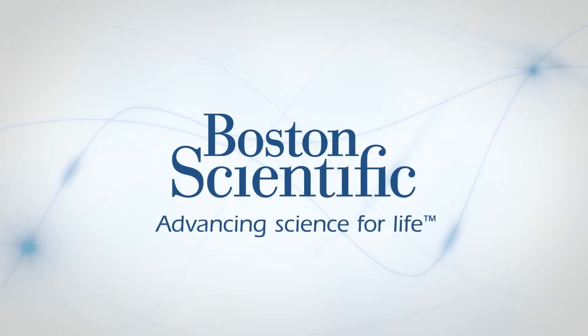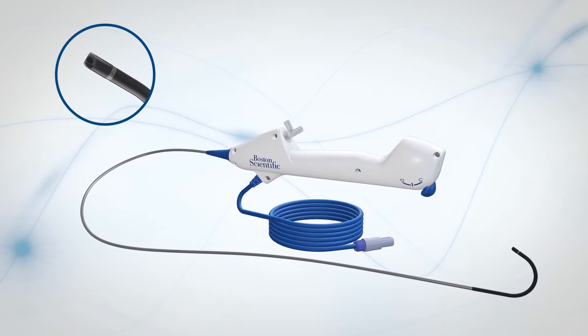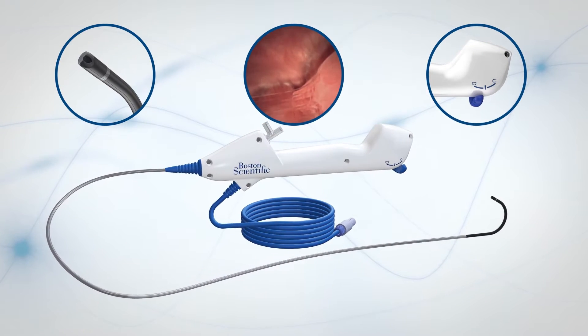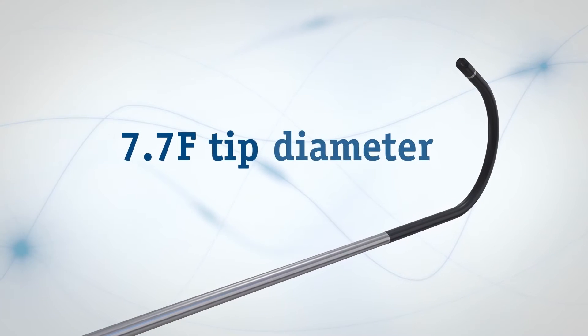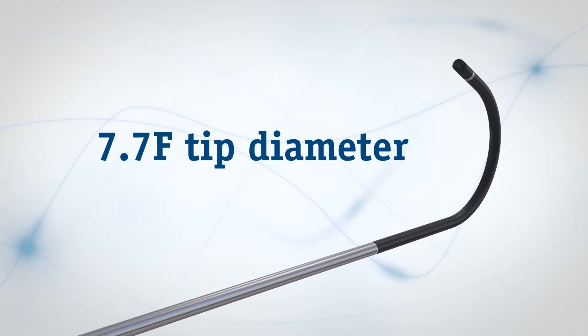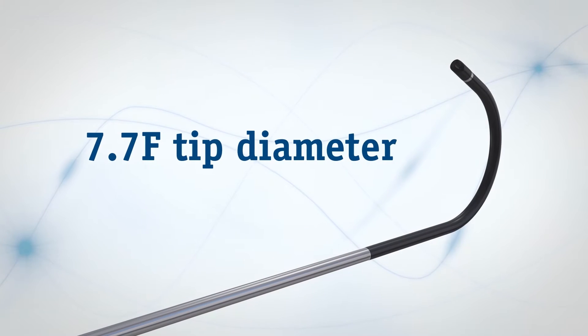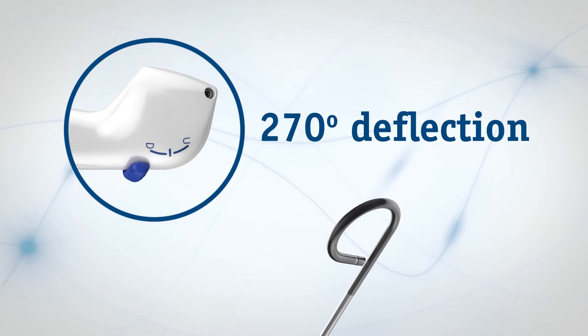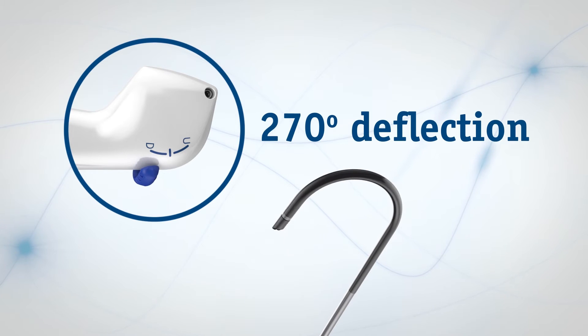With the LithoView FlexScope, your ureteroscope is always sterile, always ready. The small tip size, digital images, and flexible ergonomic design guide the way during ureteroscopy. A digital chip in the 7.7 French tip produces quality images along with full 270-degree tip deflection in both directions.